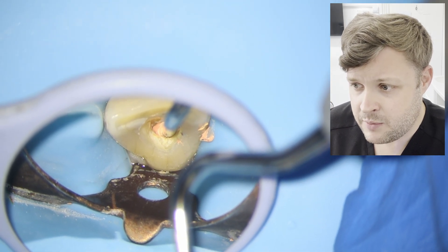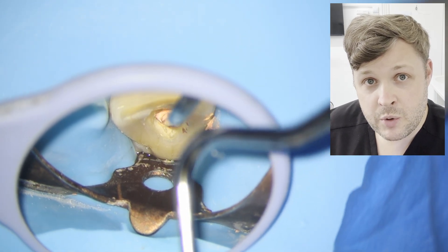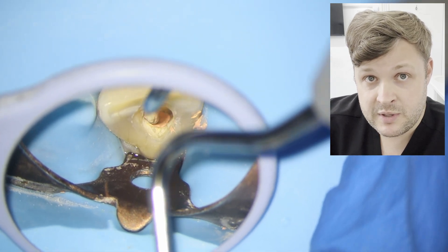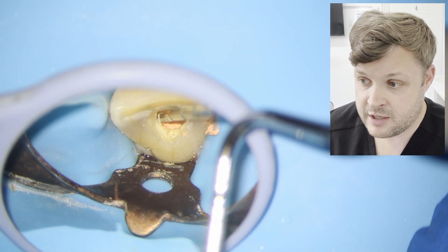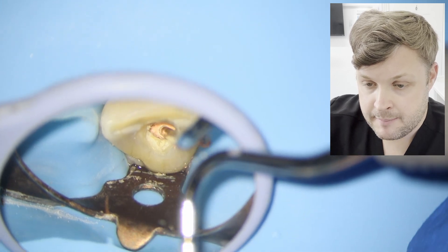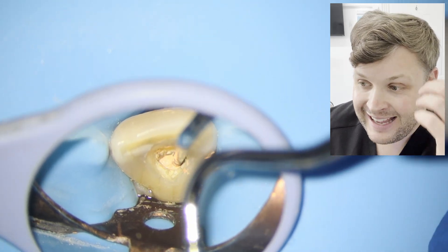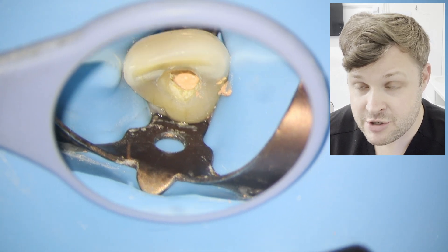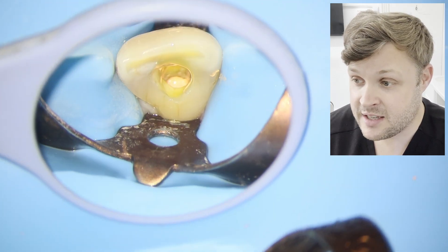I really do like working with heat. If you're a budding endodontist and you haven't used heat before, it would be really worthwhile to buy a heated unit. A lot of the time a matched cone will be absolutely fine, but especially with central incisors, upper sixes, palatal roots, or distals on lower sixes, you'll notice the canal space is quite oval and wide, and your matched cone plus sealer just isn't going to fill it completely like a monoblock, even if you're using a bioceramic. Have the heat in your back pocket ready to use when needed. That said, I'm very much a bioceramic person at the moment and tend to use that more often than not — but that's a completely different video.